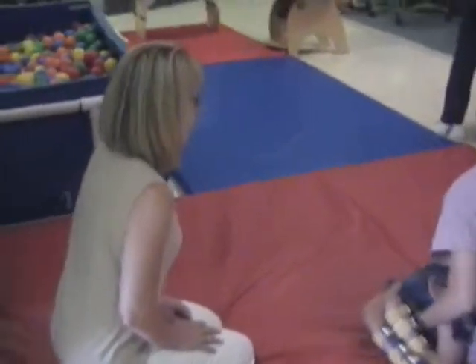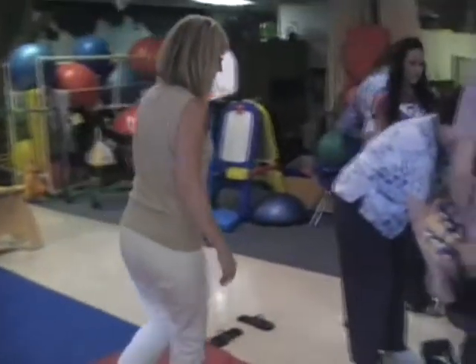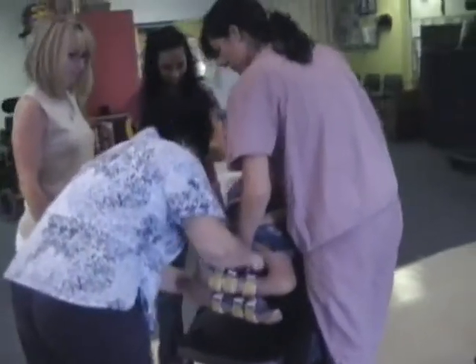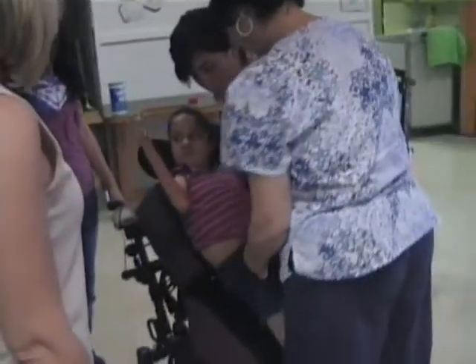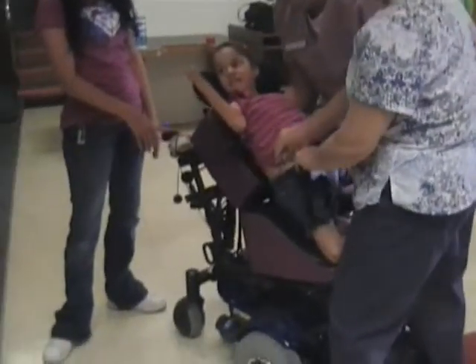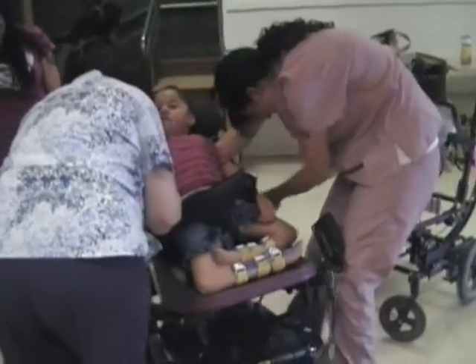This is Bonnie, who is also part of our team. She's occupational therapy and is an intricate part of our family and a wonderful part of our team. Now Ariana is being put into the power chair, where she is supported by her neck and her bottom. The seating system is taken off of the manual chair and put onto the power chair so that she stays in the same seating system, as it is a very difficult system to make for her.